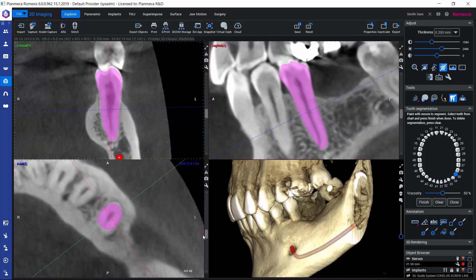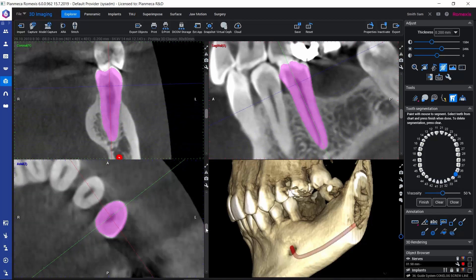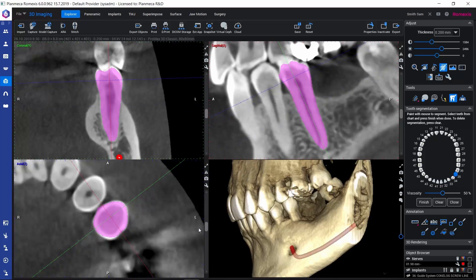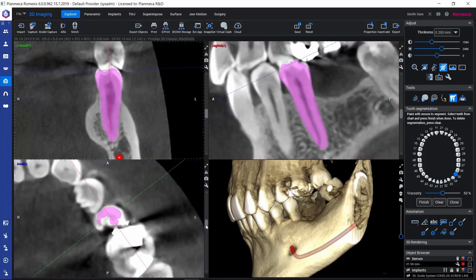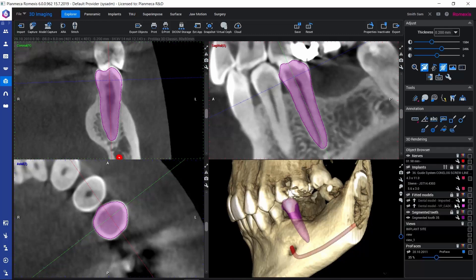Here in the axial view, we can easily add or remove paint when needed. When the segmentation is ready, we can just click Finish in order to calculate the segmentation. Now we have the segmented tooth in the 3D rendered view and also in the slice views. Then we can close this tool wizard by clicking Close.